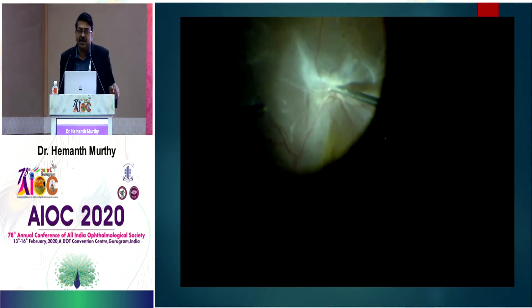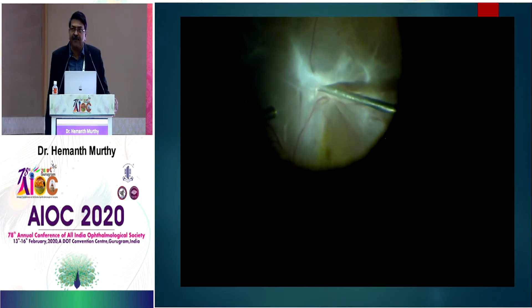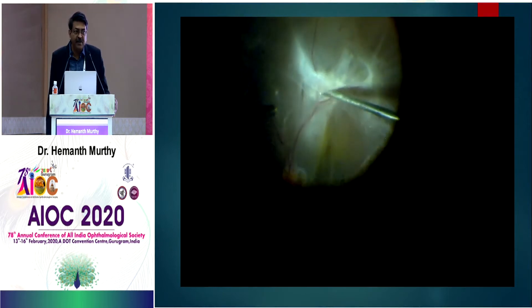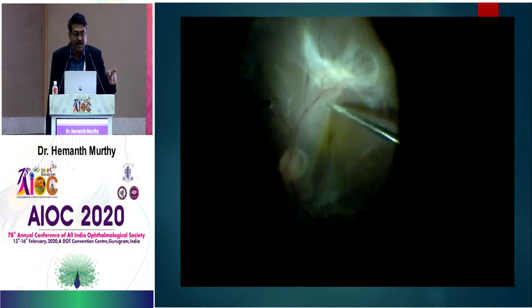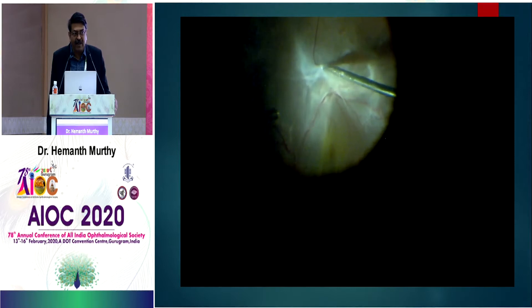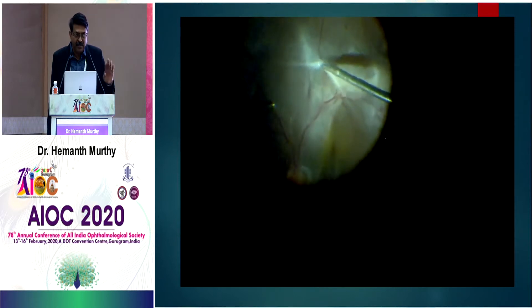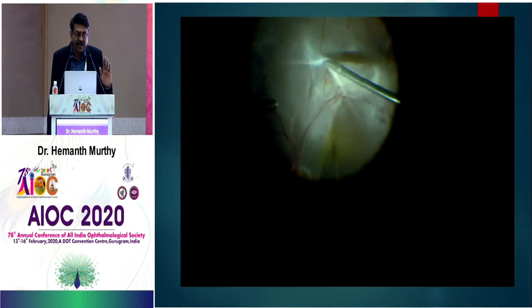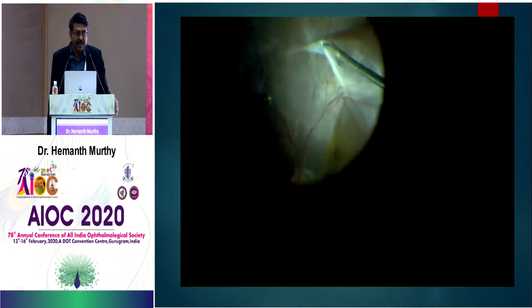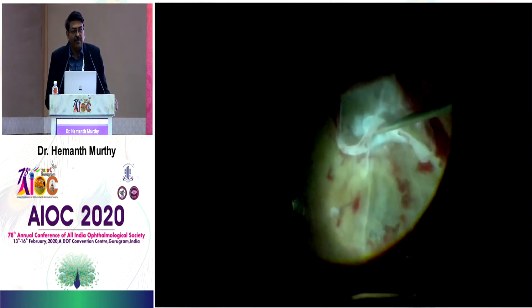A lot of times you come across situations where you cannot find the dissection plane. I use a 26-gauge one-and-a-half inch needle, slightly bent at its tip, and that gives me the dissection plane to dissect these membranes. Once I get that plane of cleavage, I know I can dissect the membrane clear of the retina. Unless you are in the cleavage plane, you will not be able to dissect these membranes and will cause a lot of iatrogenic trauma.